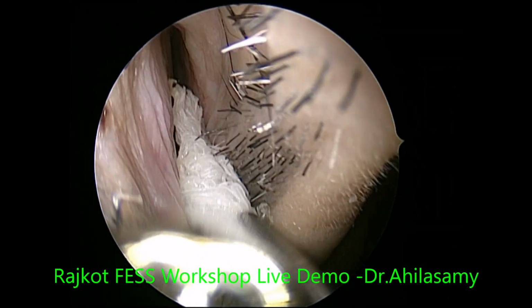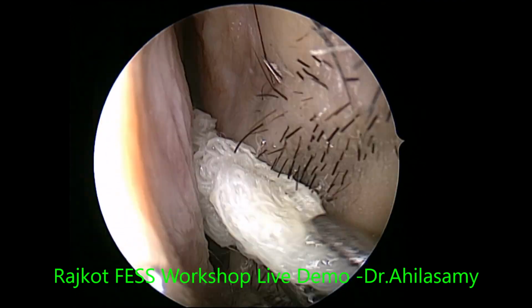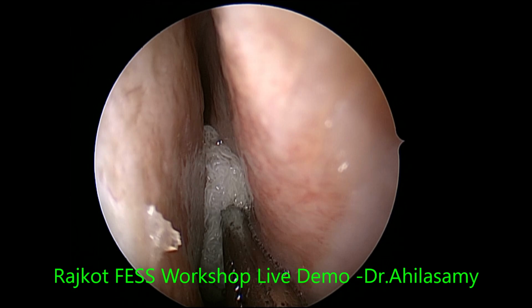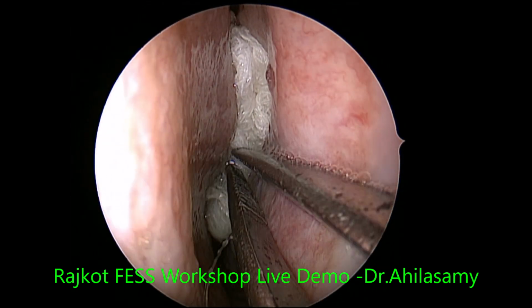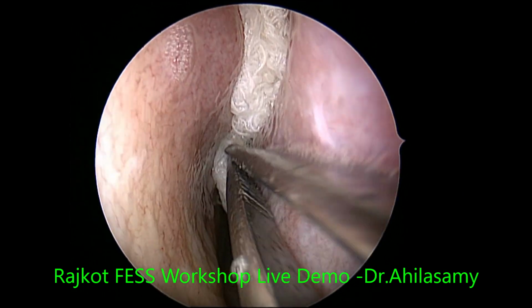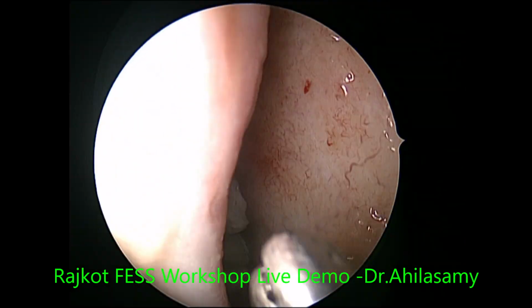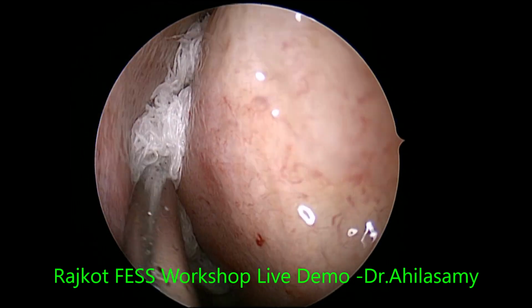So the table is 30 degrees elevated. I will show it once again. I am packing the left nasal cavity without injuring the mucosa. Very narrow nasal cavity on both sides. It has a right sphenoidal mass, and the left has a small sphenoid with mucosal thickening. That's all. I don't want to do something around it. And it has a prominent septal body also.